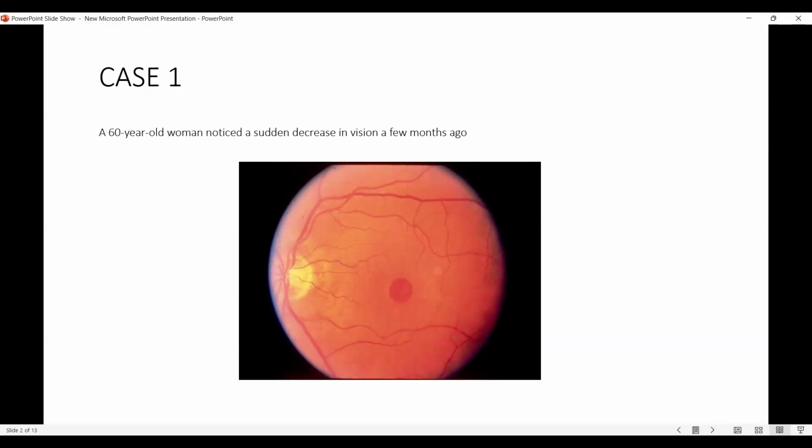We can show the patient the laser beam which is used in photocoagulation of about 50 microns diameter, and the patient can actually not see it in the area of macular hole, but if it is projected in the adjoining area of macula, the patient would perceive it. Dr. Soumya, my question is, what is the wavelength and color of this aiming beam, and why is solar retinopathy a differential in such a case, in this image? Sir, wavelength, I'm not sure. Is it a green laser?